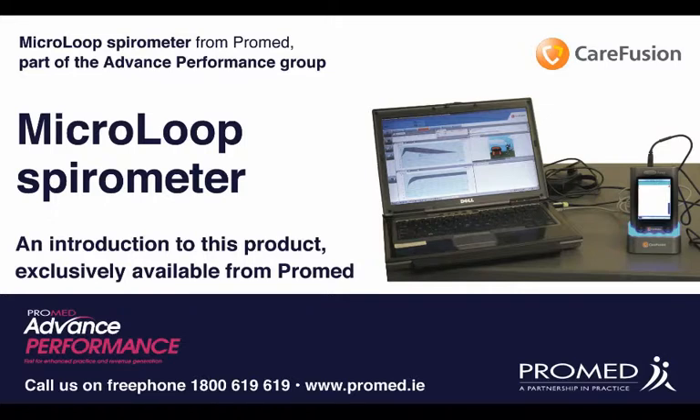Introducing the MicroLoop Spirometer from ProMed, which is part of the Advanced Performance Group of Equipment.